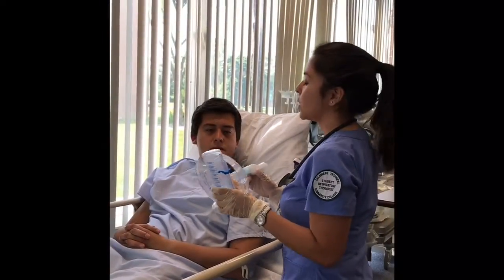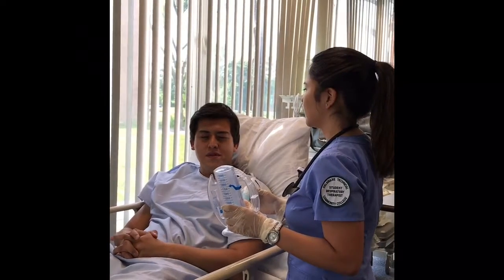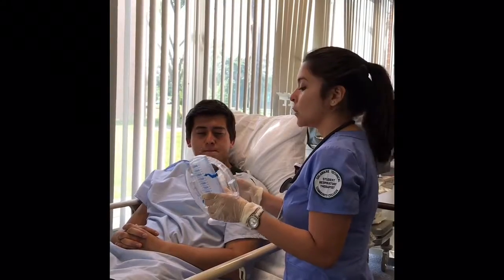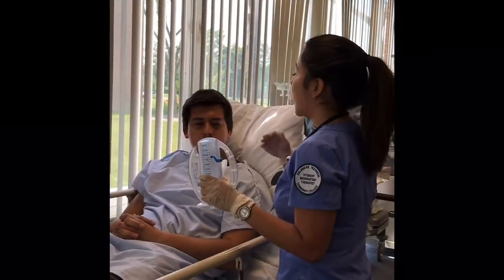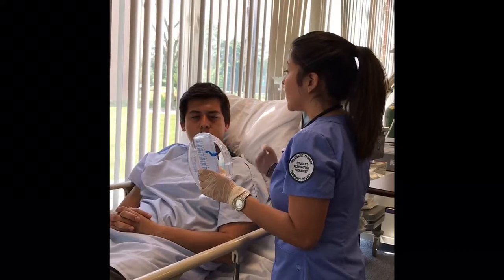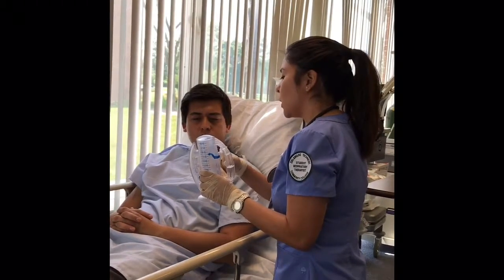Okay, Mr. Carrillo, so this is your incentive spirometer. Have you done it before? Only once, but I don't really remember. That's okay, we're gonna do it again today, okay? So this is the mouthpiece. You're gonna go ahead and make a tight seal with your lips on this. Breathe out first, and then you're gonna breathe in. As you breathe in slowly, a nice deep breath, okay? You're gonna keep this little float between these 2 arrows.